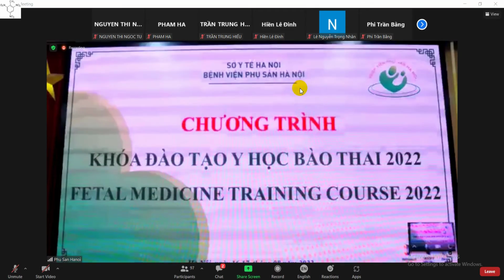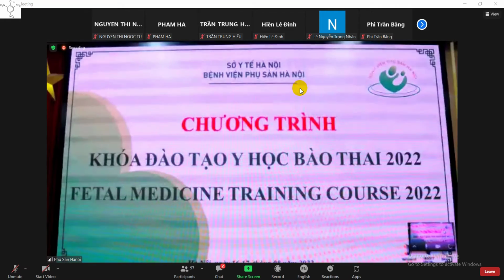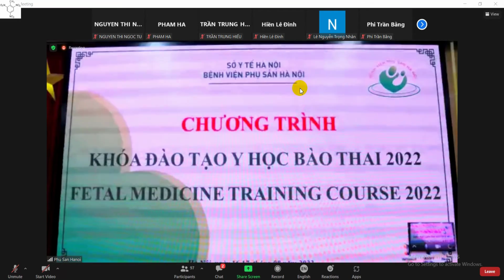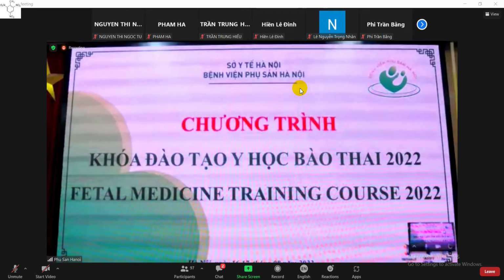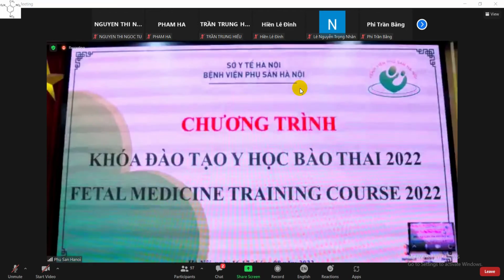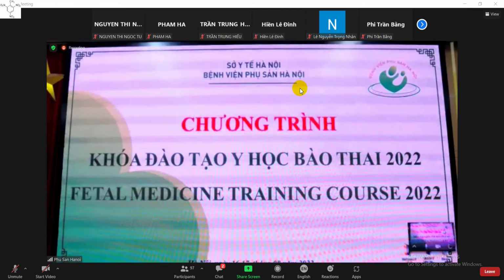Anatomical landmarks are difficult, I think, although you would want to avoid the fetal heart and you would want to try and insert the drain at the maximal point of the pleural effusion, where the pleural effusion is largest. It's difficult sometimes to insert the shunt, and usually you go between the ribs, and even if you feel the introducer touching the rib, usually it deflects and goes through the intercostal space, which is fine. A complication of this procedure can be that you can fracture a rib going in to drain, but that happens, and usually it's not associated with detrimental problems long term.